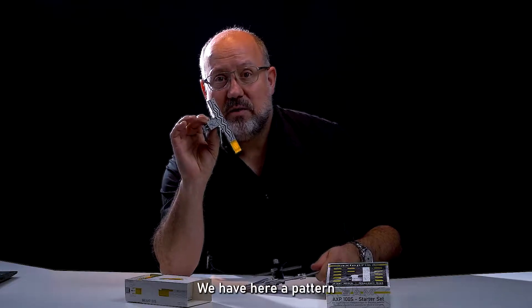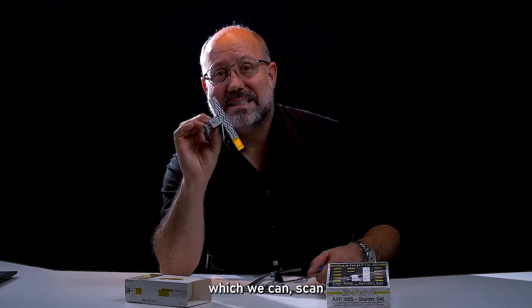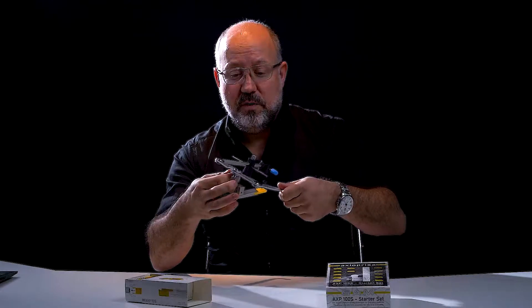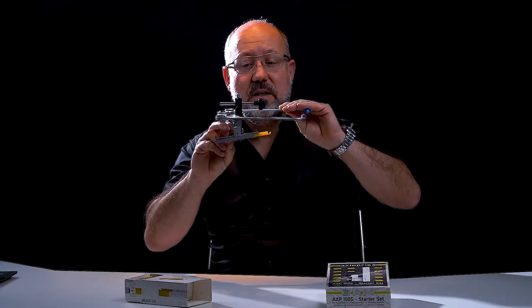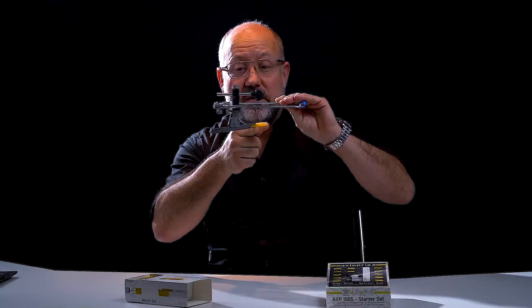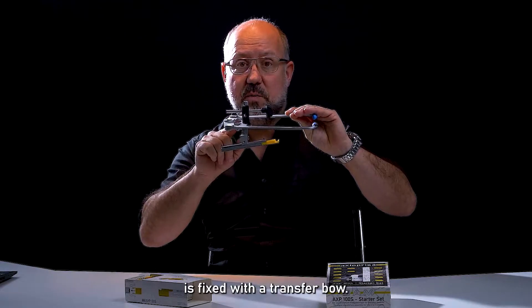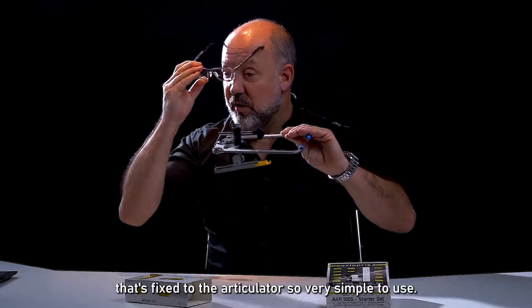A transfer fork that can be scanned and attached to the transfer bow. We have a pattern on the lower part of the transfer fork assembly, which we can scan with our intraoral scanner — because we have them in the clinic already. I attach it to the transfer bow and insert it into the mouth of the patient. You bite on it, scan roughly the surface of the occlusion, continue to your landing pattern, and that's it. Then you have the orientation, because the landing pattern is fixed with the transfer bow, which has a fixed geometry, and that's fixed to the articulator. Very simple to use.